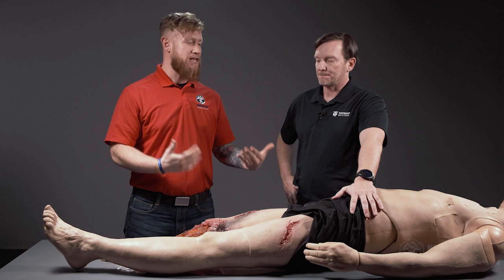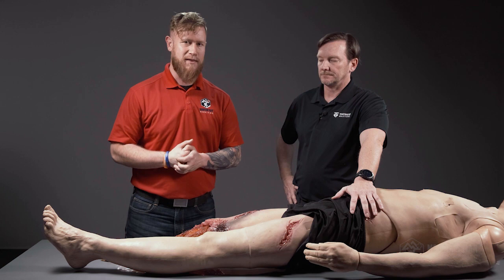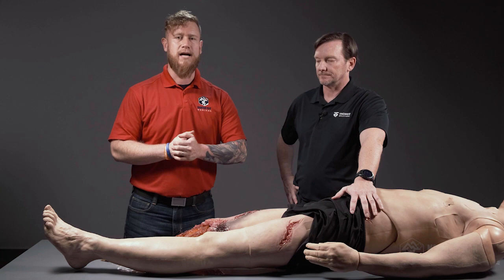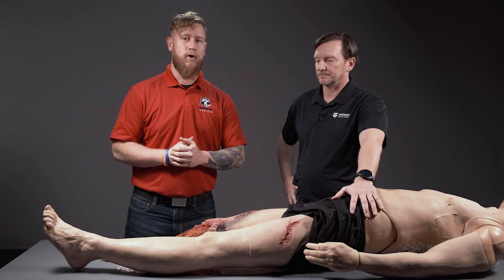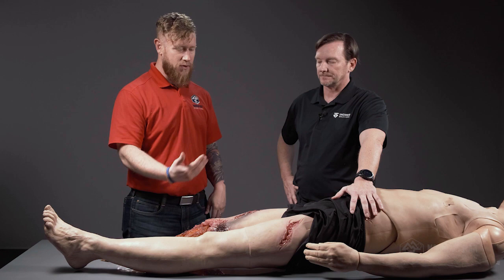Continuing our series on range medicine, Dennis Lyons with TacMed Solutions is our subject matter expert. We're working on one of their exclusive, hyper-realistic mannequins to break down common injuries on the firearms range — gunshot wounds. We'll walk you through basic tips and tricks. For more in-depth study, head to mountainmadmedical.com, click the training tab, and find a free online trauma course that teaches you how to use all the items in your trauma kit.